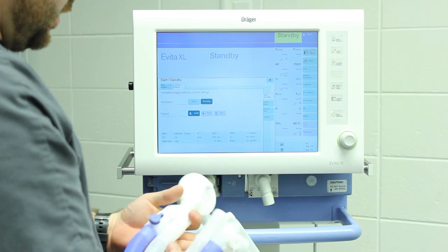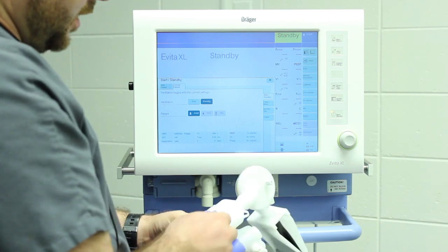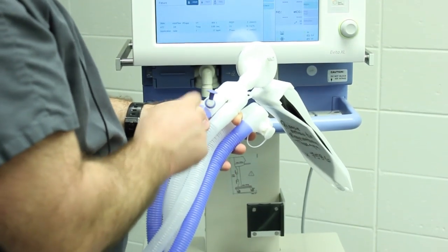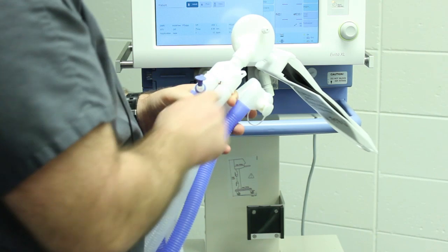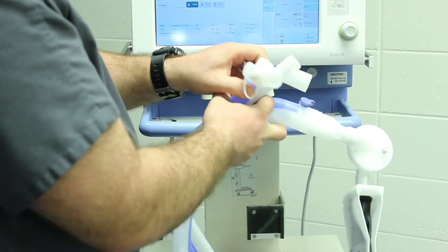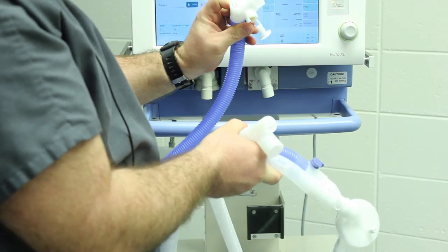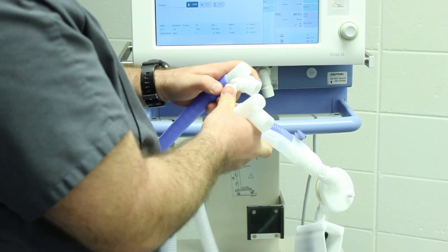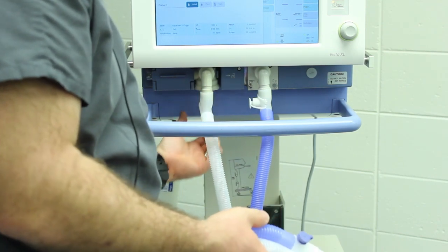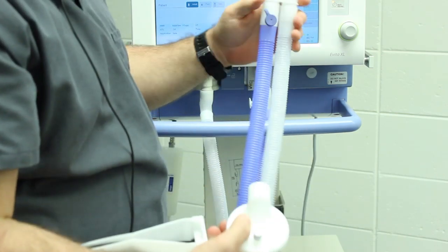For the circuit: how do you know which side is inspiratory? Whichever side has the probe area is the inspiratory side, because that's where a temperature probe would go — you want to measure the temperature of the air before it gets to the patient. It would do no good to measure it after it came away from the patient. So always know that whatever side has the temperature probe is inspiratory. In this case that's the blue one. It has an extra port on it — if that comes undone, it's a big source of leaks, so make sure it's closed. That just pushes up into the vent here, and by process of elimination, the other side is your expiratory.